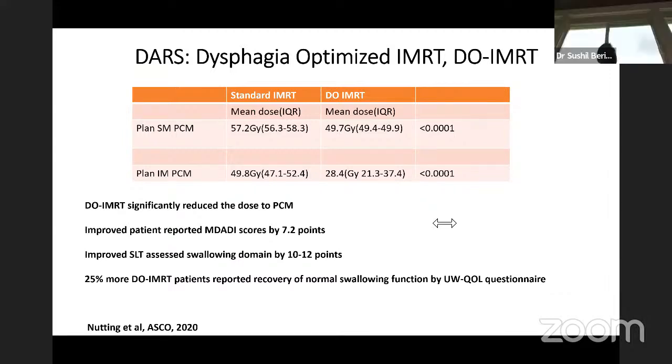So two things. I'm glad you brought up the question. When we do CTV to PTV expansion, if it comes close to the skin, we bring it 3 millimeter from the skin because of ease of planning, because those calculation algorithms at skin are uncertain. But that being said, if skin is at risk, then you may consider small bolus. But say, for example, if your nodal contouring comes close to the skin and you don't think skin is at risk, you should use a module called auto flash, which is there in the treatment planning system. By auto flash, what you mean is you create a flash in that area. So like 3D, but you do with IMRT or VMAT.